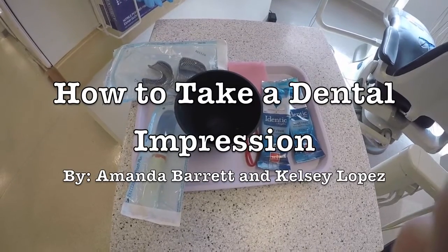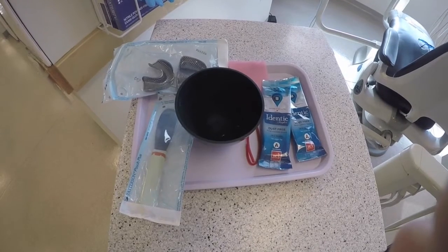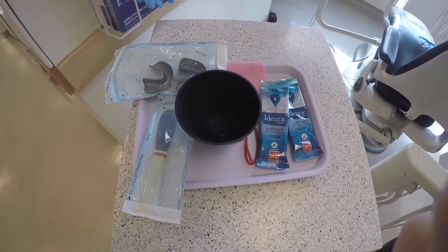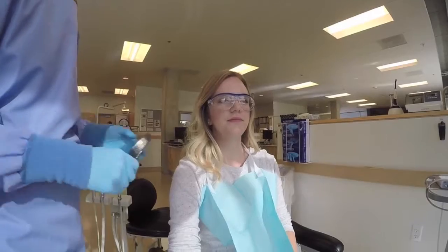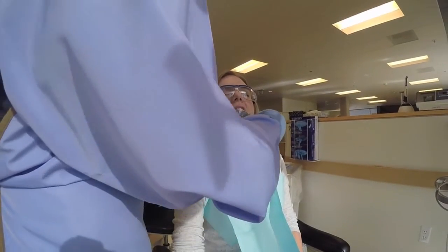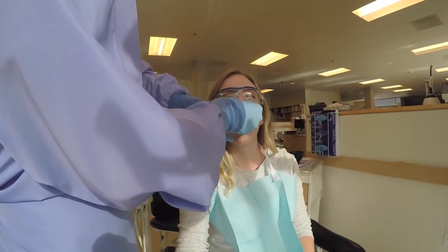In this video, we will be showing you how to take a dental impression on your patient. First, you will gather supplies including your mixing bowl, spatula, wax strip, wax square, 2 alginate packs, trays, and scissors. You will then size the trays on your patient, ensuring that the tray can fit in their mouth and extends far enough back to cover all the necessary anatomy.